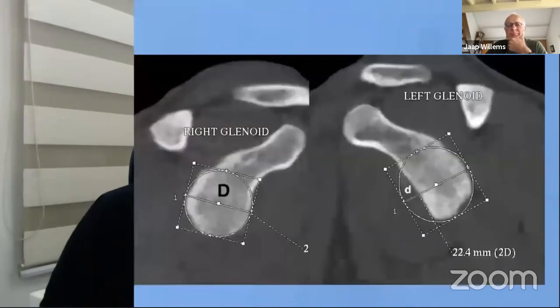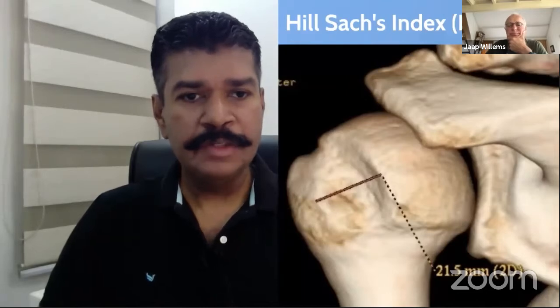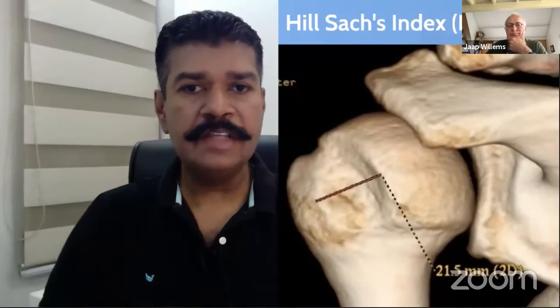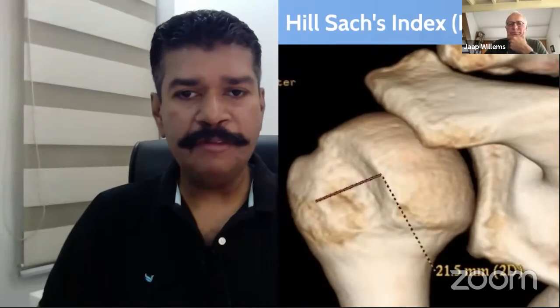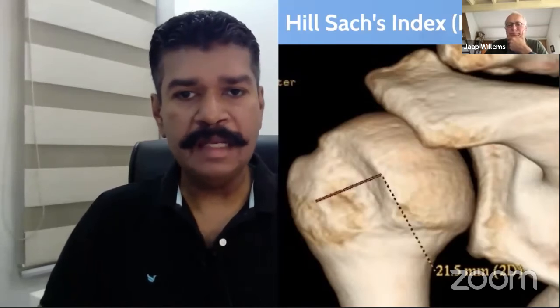The measurements have been taken using CT scans. Now the Hill-Sachs index of the same patient is measured to be 21.5. So while there is a glenoid track of 17.7, the Hill-Sachs obviously is much bigger than the glenoid track. So this is a case of an off-track lesion, and you may have to do something to address the Hill-Sachs while you are planning a surgical intervention for this particular patient.